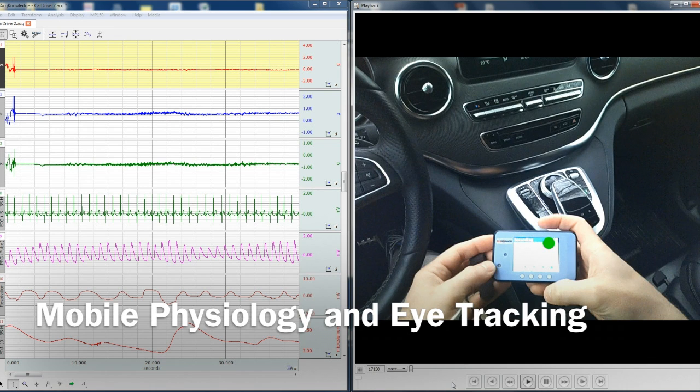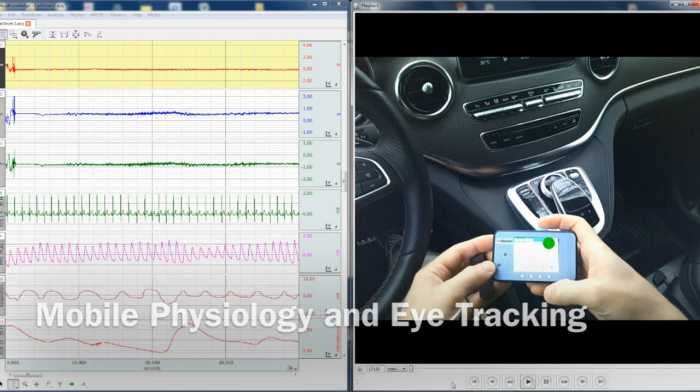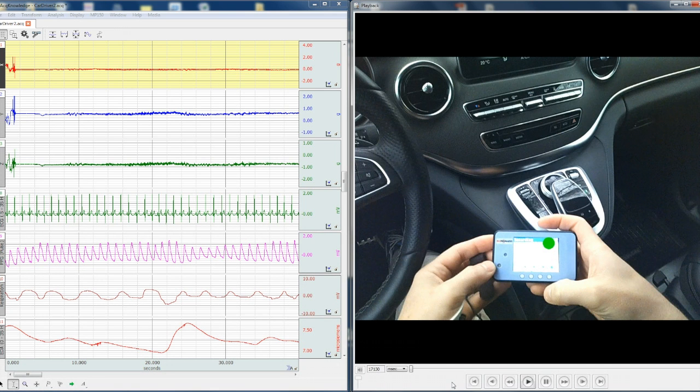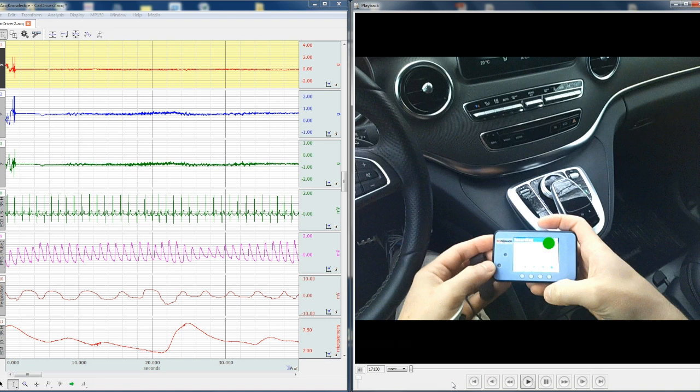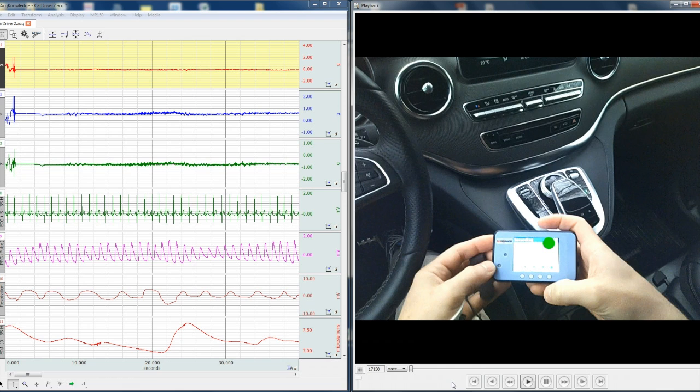the physiological data that was downloaded from the logger. Top three channels of X, Y, and Z from the accelerometer which is on board the logger, and then beneath that we have signals from the heart ECG, pulse, respiration, and electrodermal activity. Those signals were captured using the bio nomadics transmitters placed on the subject.